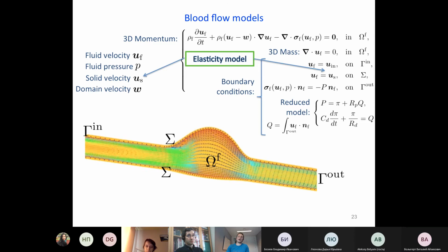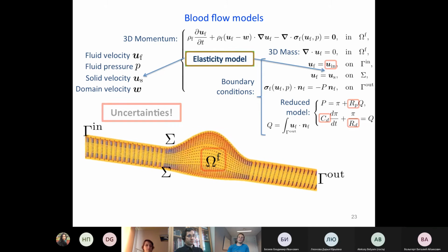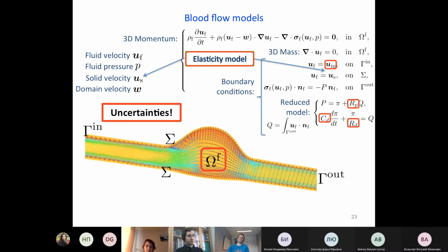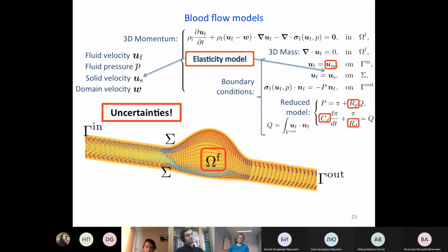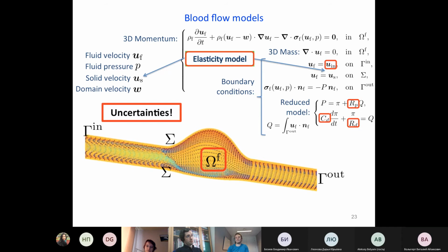So what actually the problem is now, the idea is, when you use integrating data, so doing this PDE constraint optimization, it is necessary because the model has several uncertainties. So I just put some of the typical uncertainties in the problem. Boundary conditions in the fluid are uncertainties that you will actually estimate from the data, and then therefore you will create the extended data, so the 3D velocity field, for example.